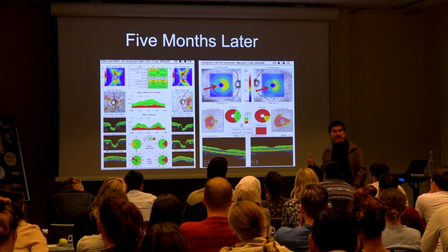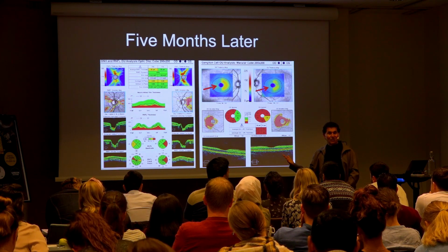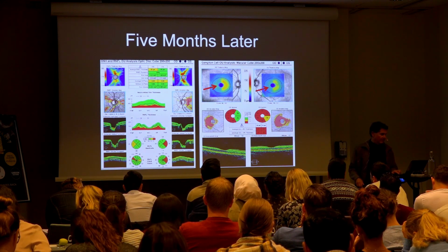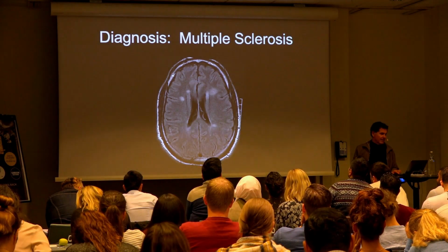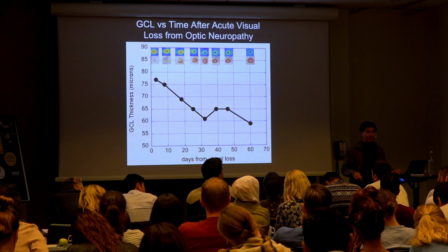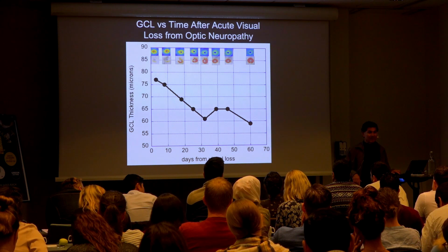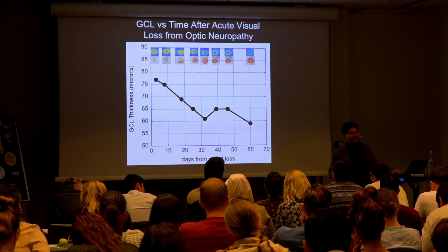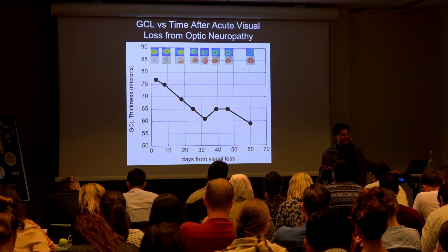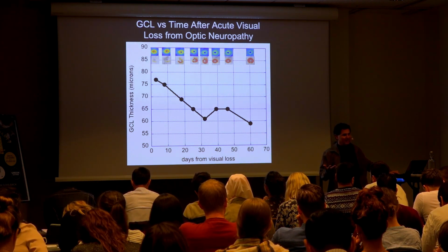And just like in optic neuritis, you have a return of visual field, but you see footprints of ganglion cell loss. So think of that as a footprint of previous demyelination. So she had MS. Well, she had previous optic neuritis in both eyes and now had a new tract lesion. That's how I put it together, based on the ganglion cell. See, the ganglion cell helps tell you the story of what the footprints were at the time she presented. There was something there before in each eye, and now she's got another area of demyelination, another location.